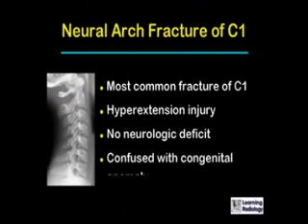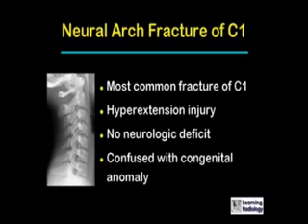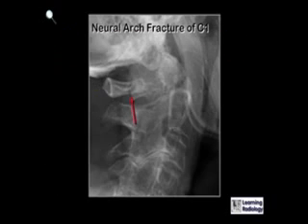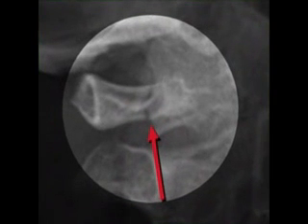Neural arch fractures of C1 are the most common fractures of C1. These are usually hyperextension injuries with no neurologic deficit. They can be confused with congenital anomalies and you have to be careful of that. This is an example of a neural arch fracture of C1 — the red arrow is pointing to a vertical lucency, which is a fracture through the posterior neural arch.